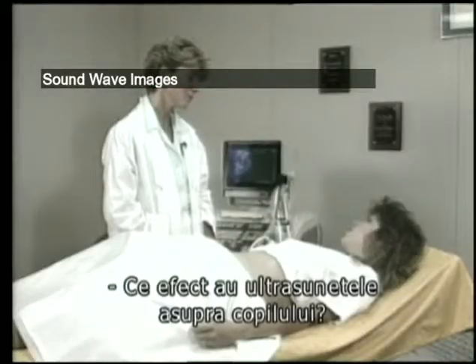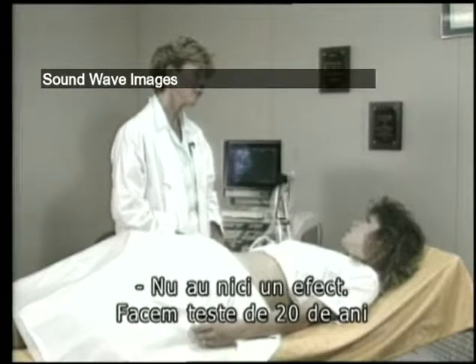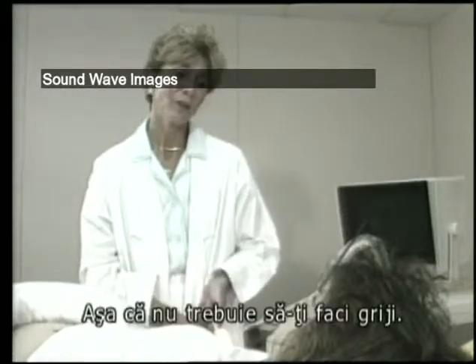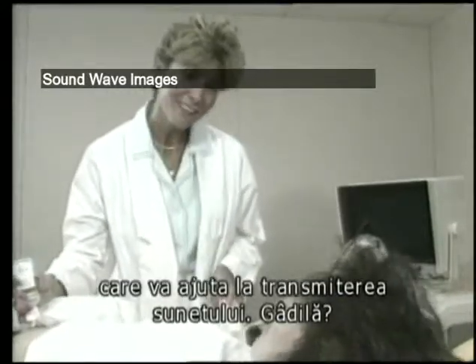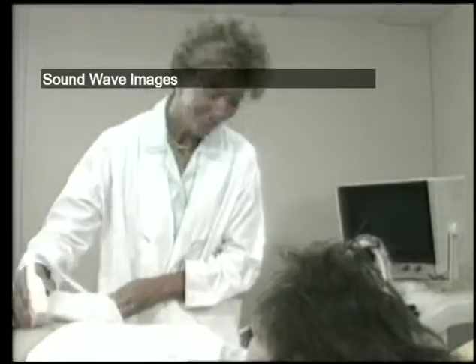Will ultrasound have any effect on the baby at all? No, not at all. In fact, we've been doing tests for 20 years, and they haven't been able to find any biological effects at the diagnostic exposures we use. So you don't have to worry. Anyways, I'm going to get started now. I'm going to put some cold gel on you. There you go. That's going to help transmit the sound. Does that tickle? It's cold. Okay.